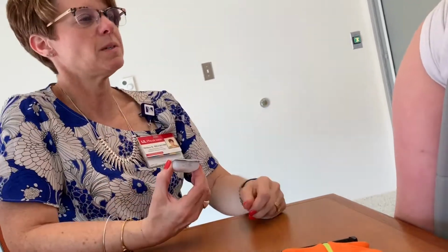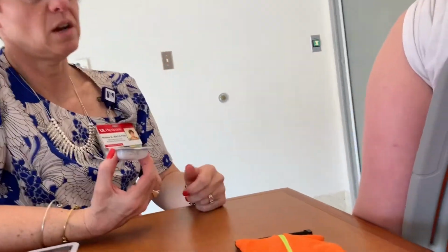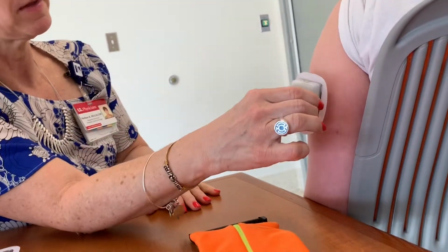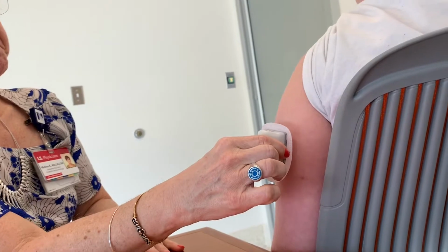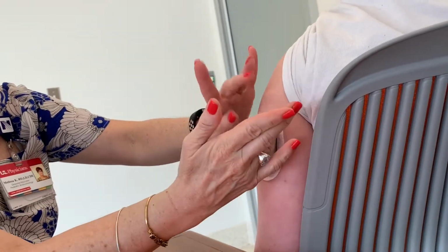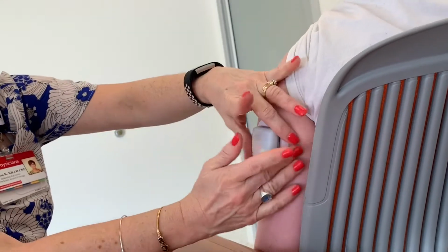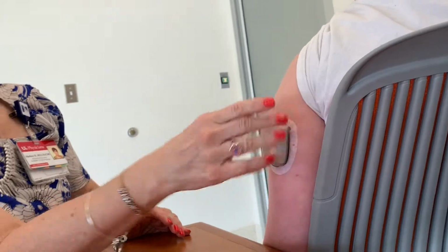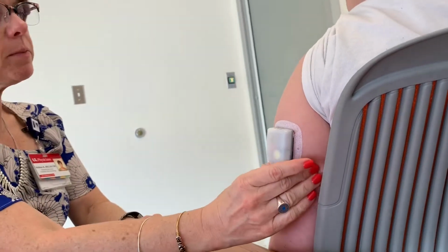Your Dexcom stays on for 10 days. This is only staying on for 2 or 3. Okay, so I just want to make sure it's dry. Does it matter which end goes up or down? No, I'm just doing it this way. I don't particularly have a rhyme or reason on this. If we get it closer to the elbow, I would flip it around, but yeah, that's good. Do you want me to pinch up like this?